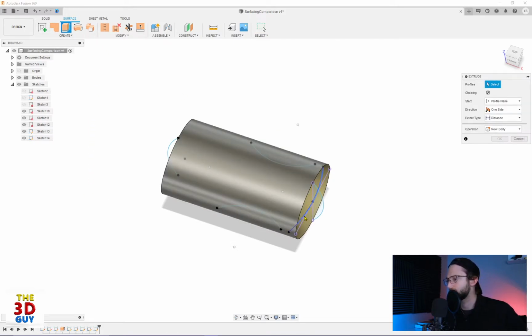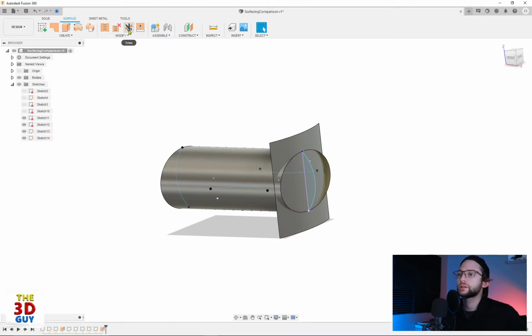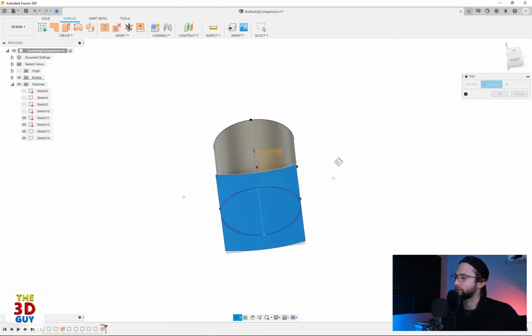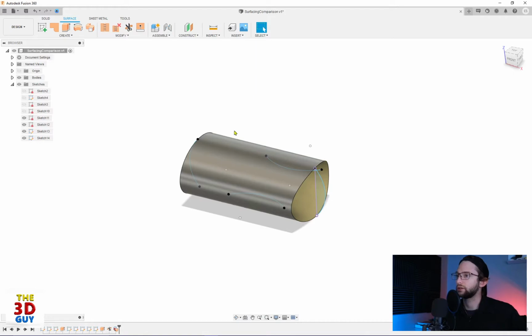So we'll extrude this guy. We're going to go up, just do symmetric, and call it good. So then we have the trim, real similar to SolidWorks, our trim tool, and then we can select what we're going to trim after that. So that's something that's a little bit different. With SolidWorks, you can see that it has both. Fusion 360 just has the one. And I'm actually just going to click on it and click delete.